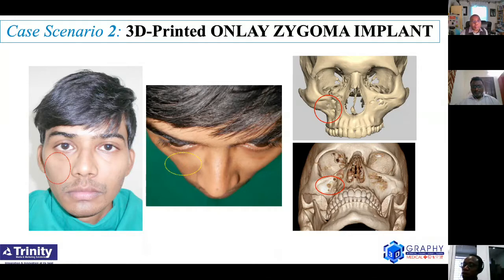Many in my field would say that this is an overkill. But if you ask me at this particular stage whether this was an overkill, I would underplay it, saying that it's not an overkill, but we responded to the patient's call where he was psychologically affected and we replaced like with like. When I say replaced like with like, if you see the CT scan images, you can see that there is a fracture there on the right side, which is depicted by my arrow, by my circle in the red.